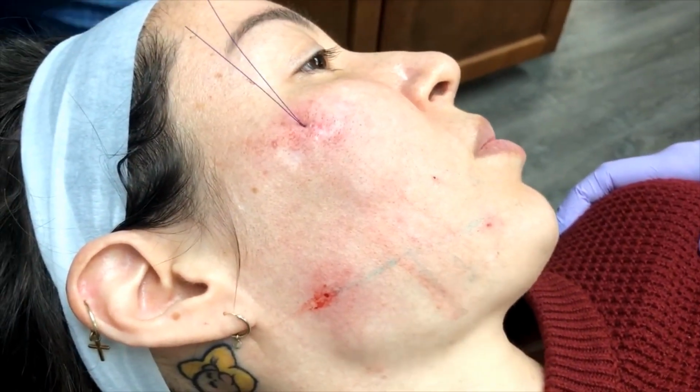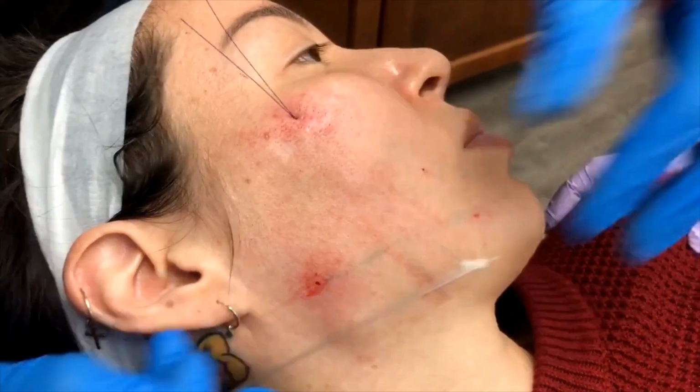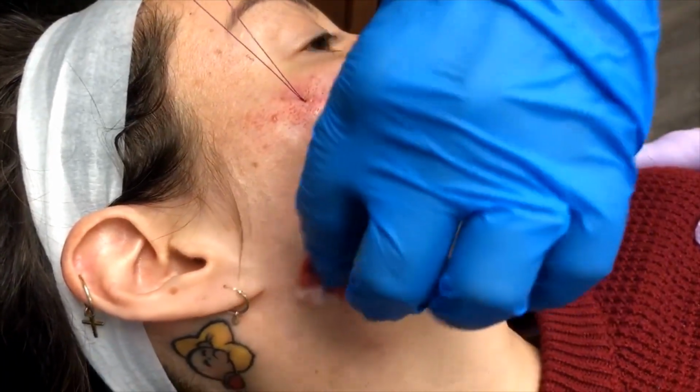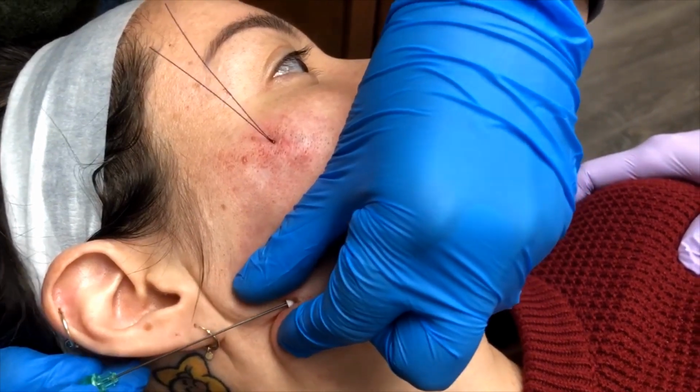Make sure your PDO threads are also FDA cleared class 2. That is so important. There are only 3 companies on the U.S. market that have the proper packaging and are FDA cleared class 2, and V-Soft Lift is one of them.